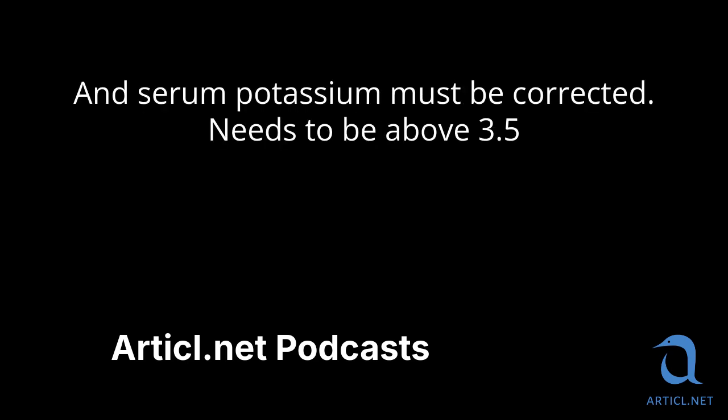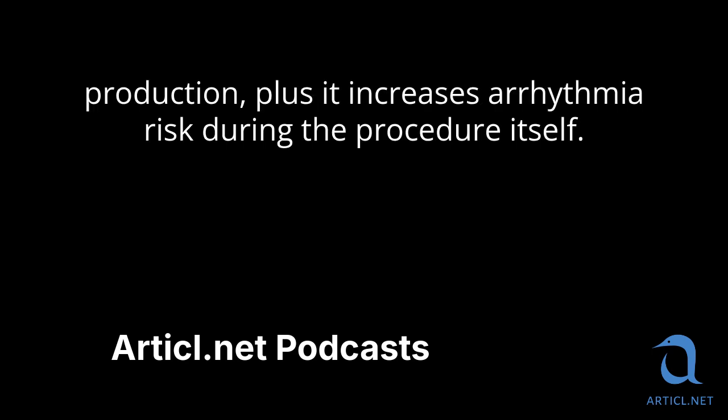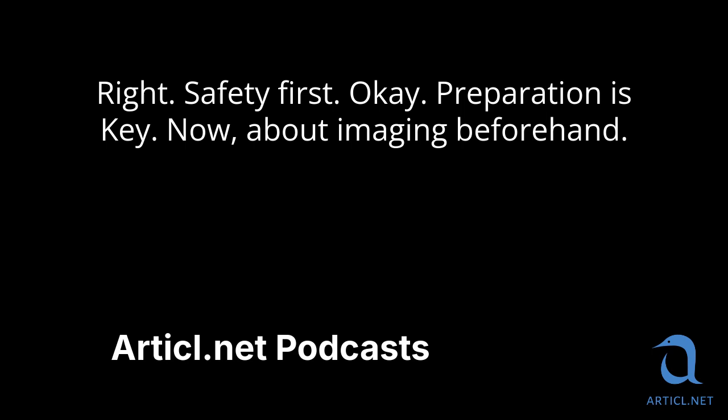And serum potassium must be corrected, needs to be above 3.5 millimole if they're hypokalemic. Low potassium inhibits aldosterone production, plus it increases arrhythmia risk during the procedure itself. Right, safety first. Okay, preparation is key.